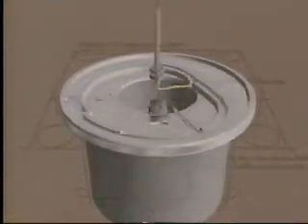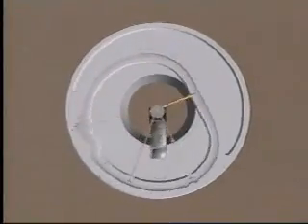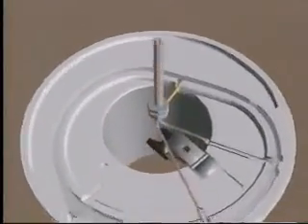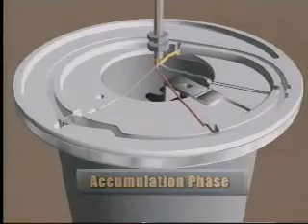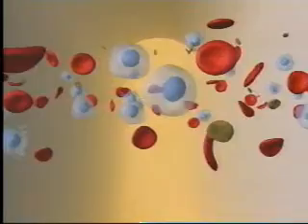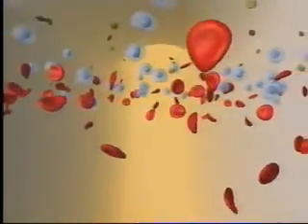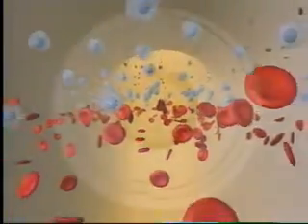Auto PBSC collects peripheral blood stem cells using a dual-stage channel and a three-phase process that repeats throughout the collection procedure. In the first phase, the accumulation phase, anticoagulated whole blood enters the system. As the whole blood enters the centrifugal field established within Spectra, the heavier red blood cells and granulocytes are first to sediment in the channel.